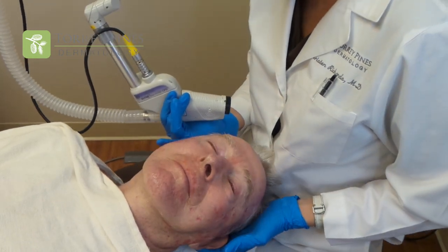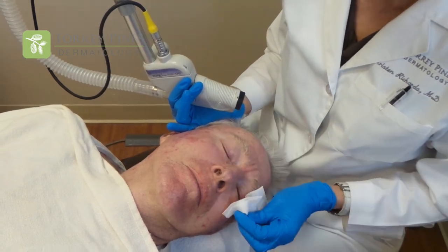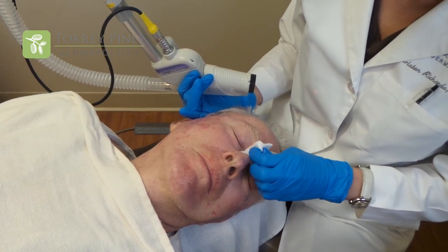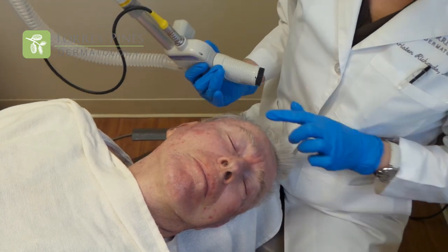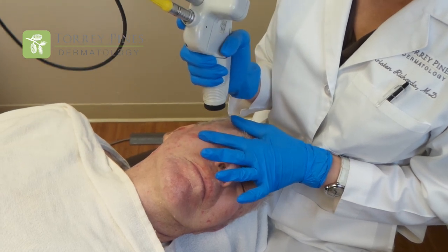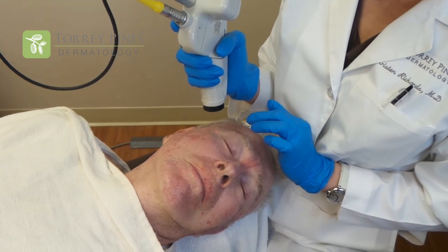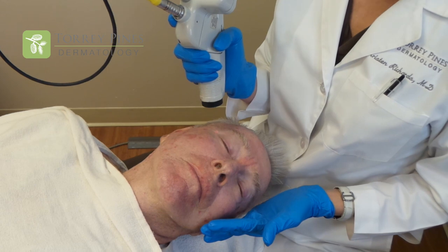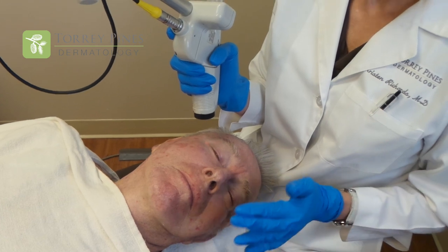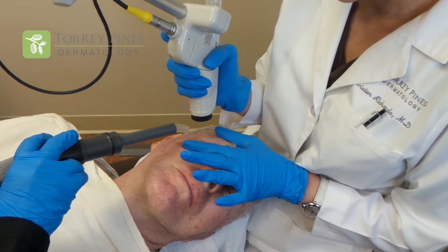We start by working around the eye area. The area around the eye tends to get quite a bit of sun damage — it's very thin skin and it likes to absorb all of those UV rays, so there tends to be quite a bit of sun damage surrounding the orbital area. We use cold air that helps to take away the heat of the laser. Our patient has been numbed prior to the procedure, and now we're using the cold air in addition to take away any discomfort.